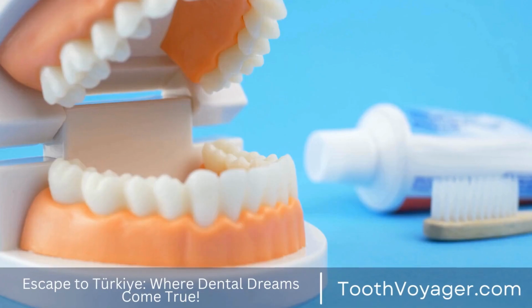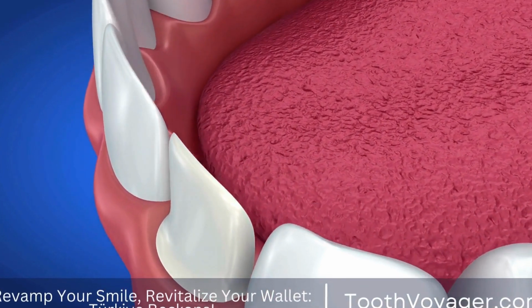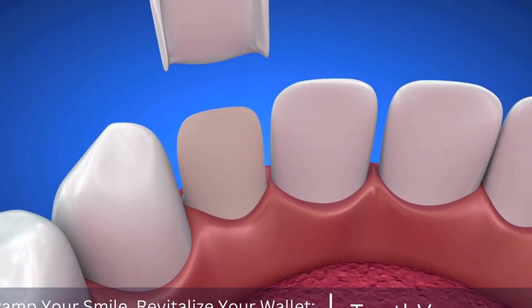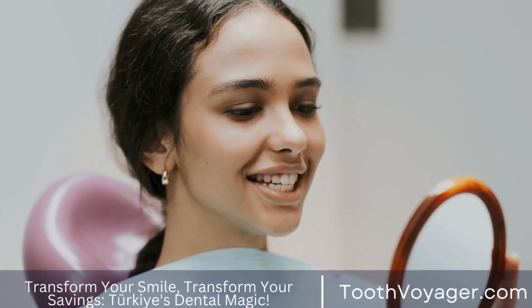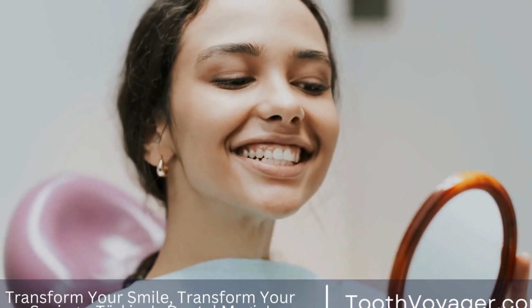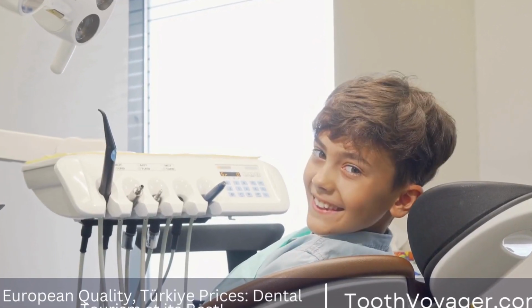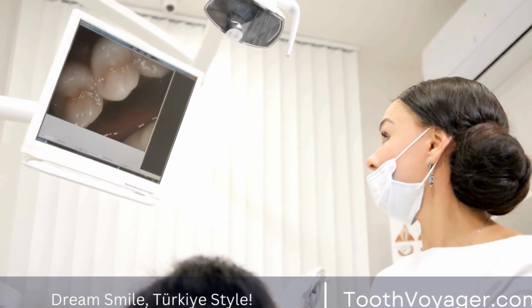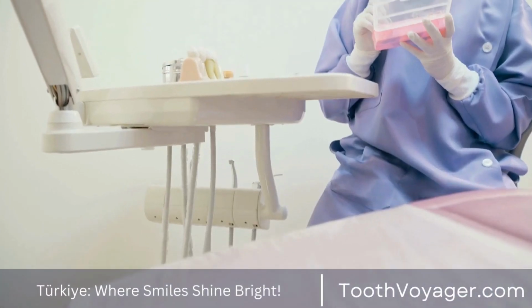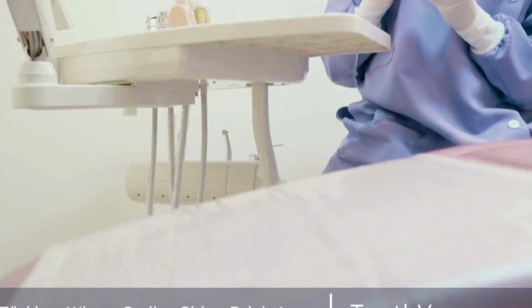2. Mini dental implants. Mini dental implants tend to be smaller in diameter than traditional ones. They are commonly utilized in instances in which there's insufficient bone mass to hold a traditional implant. They can be placed by a minimally invasive procedure and are a preferred alternative for patients looking to steer clear of more extensive surgeries. Small dental implants are commonly utilized to strengthen dentures and bridges. They offer a more secure and comfortable fit for the replacement tooth. It is also possible to use them for replacing narrow or small teeth where conventional implants might not work.